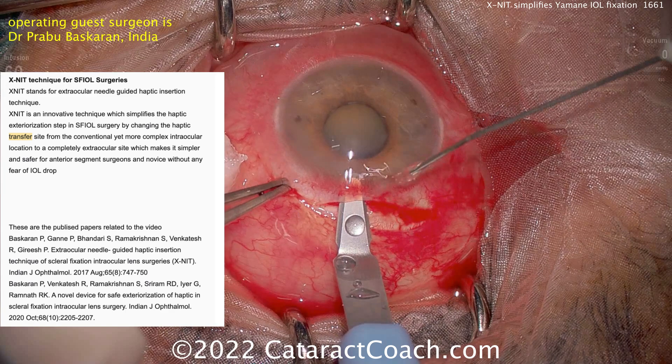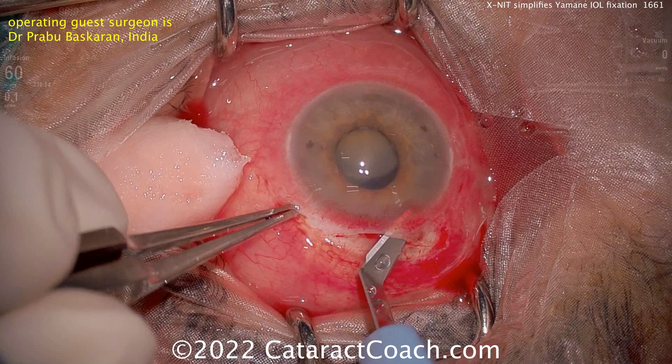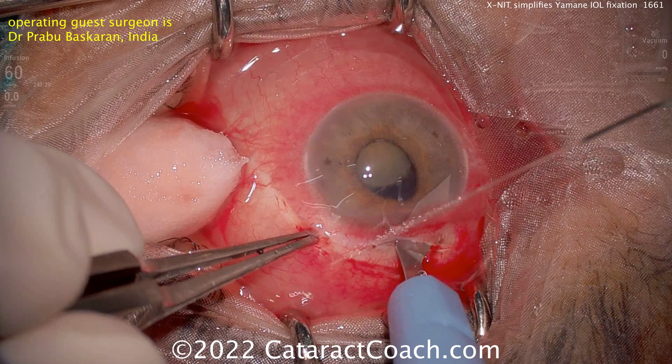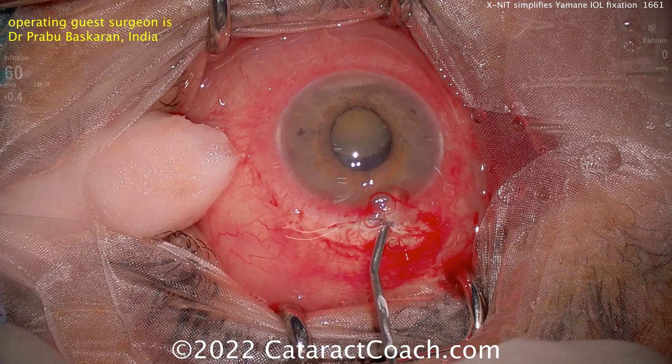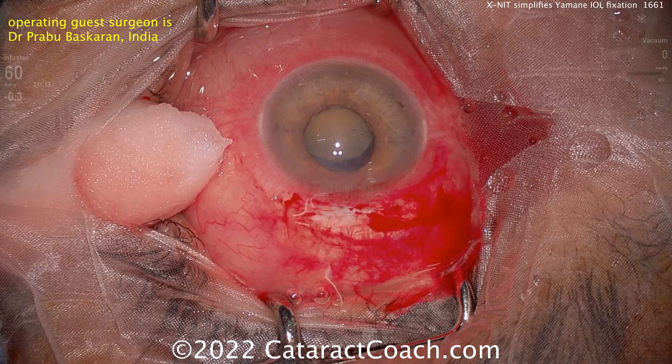One of my criticisms of the Yamane technique, as done by most surgeons, is if you're not doing a full pars plana vitrectomy, oftentimes with techniques done inside the eye, you'll get that haptic on one side of the lens going deep into the mid-vitreous. Watch some of those Yamane cases and you'll understand why, for the regular Yamane technique, the patients are best served with a full pars plana vitrectomy. That was the original study by Shin Yamane.